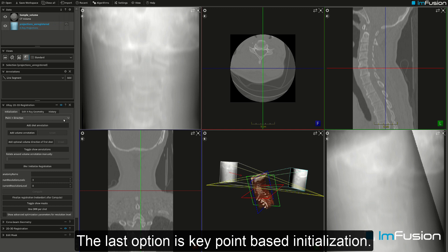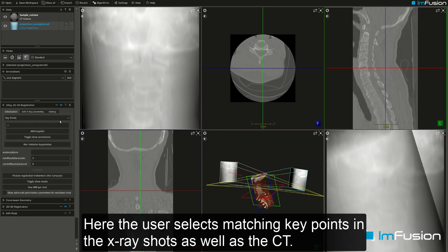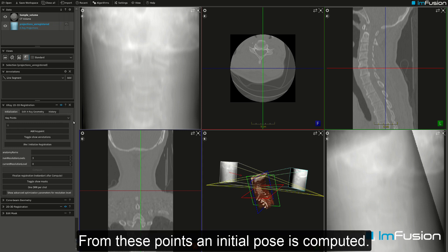The last option is key point based initialization. Here the user selects matching key points in the x-ray shots as well as the CT, and from these points an initial pose is computed.